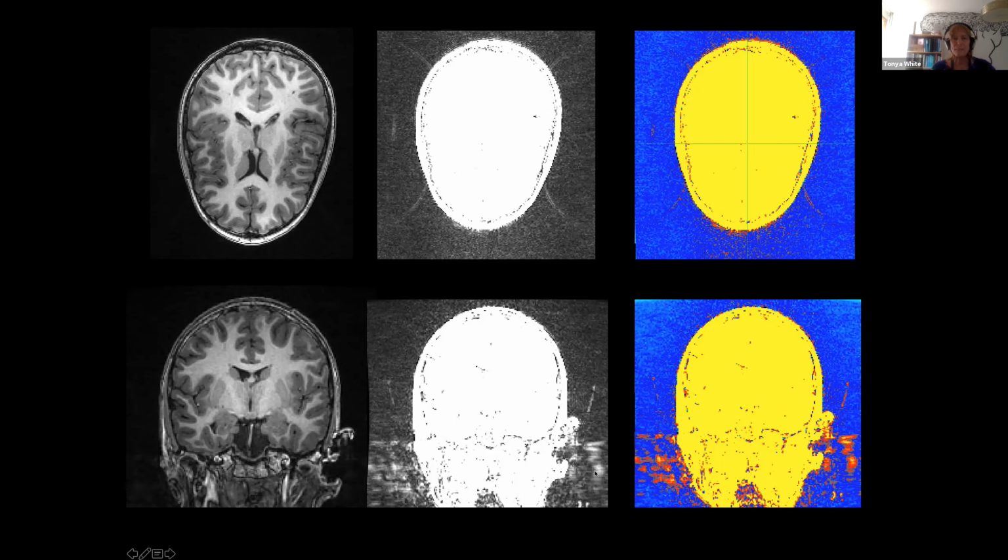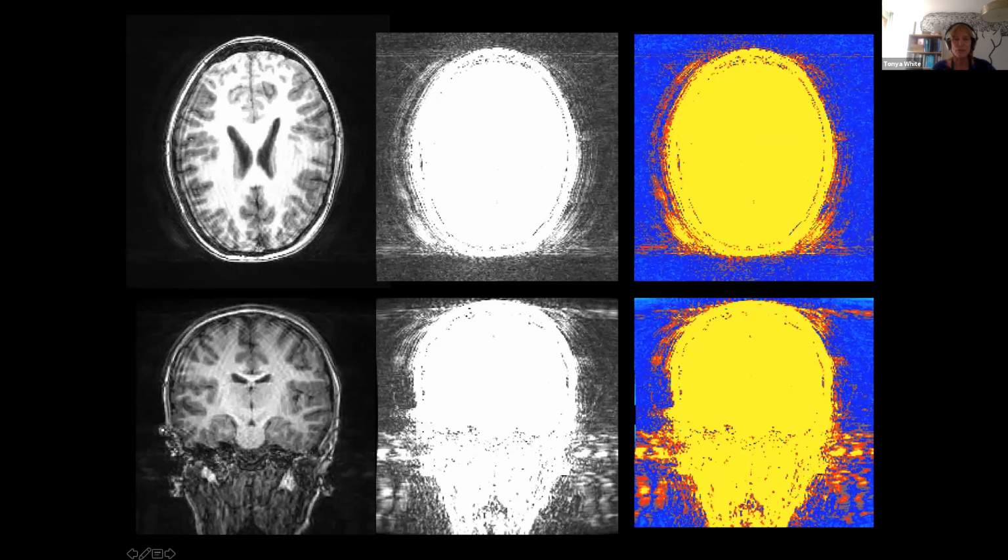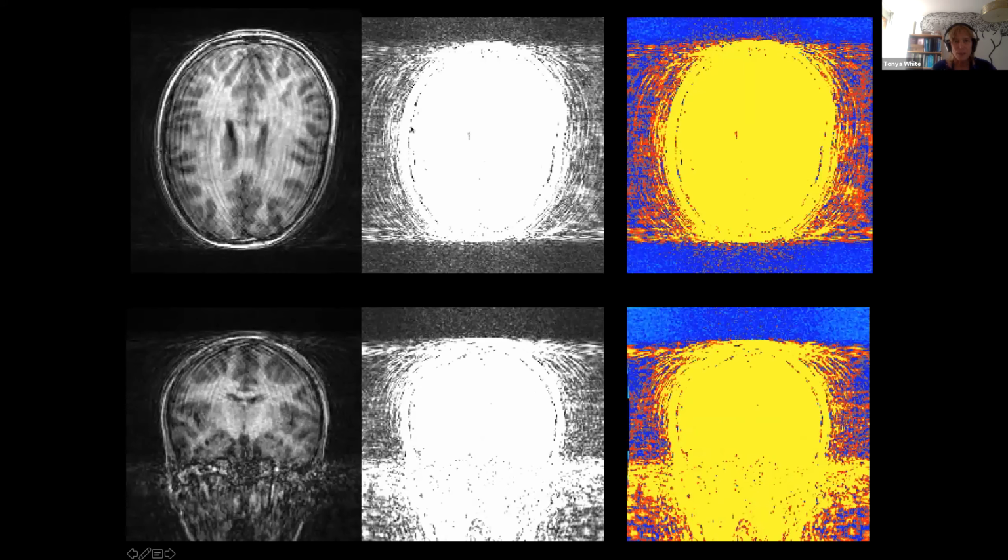Then you go to the medium scan. So here's the original image, non-thresholded. But then when you window it, with much smaller windowing, you really see more of what's happening outside here. And then you see it even more with the severe image, right? And in fact, one of the things I saw here, what you would expect when you do a Fourier transform and how movement characteristically appears, is you see the ringing, the waves that propagate out from the side of the brain.